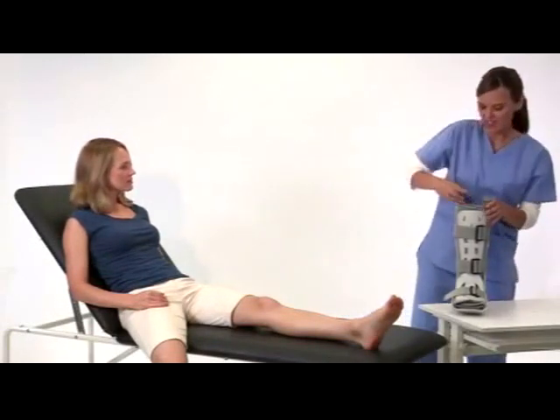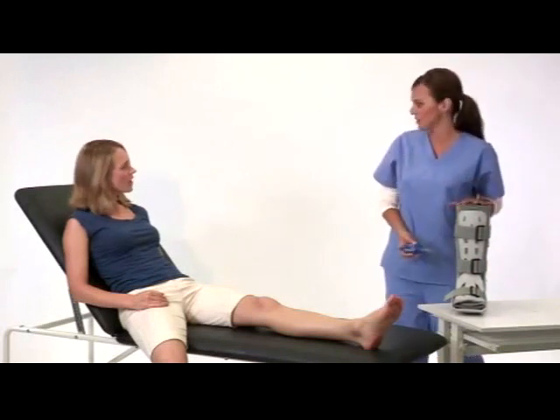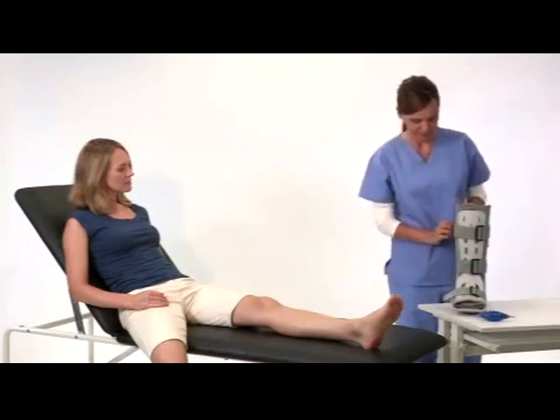Your FP walking brace includes an inflation tube. You may want to wear a cotton or cast sock for enhanced comfort. Start by preparing the brace.